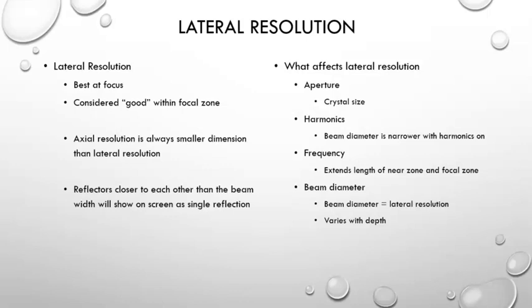Harmonics affect the lateral resolution. We haven't talked about harmonics yet, but just remember that a narrower beam diameter occurs with harmonics. Because the beam diameter is narrower, the lateral resolution is better. Remember, beam width or beam diameter is lateral resolution.